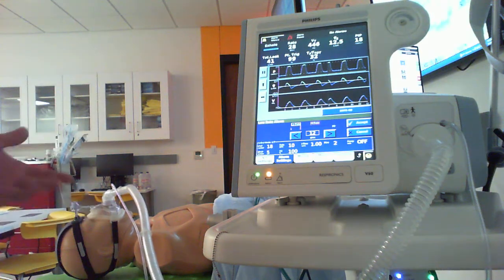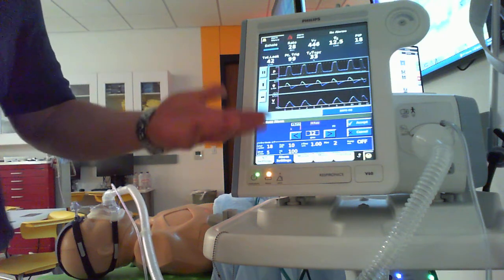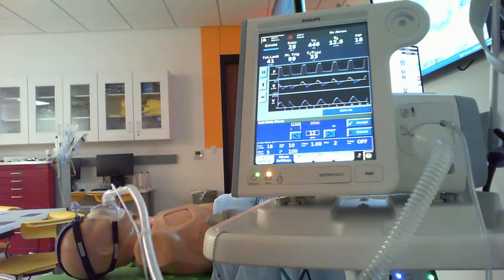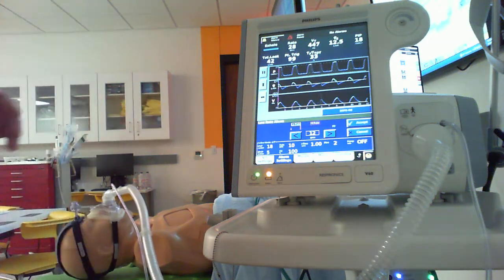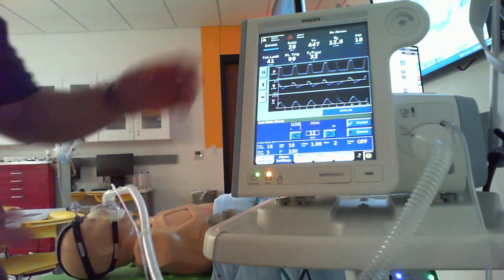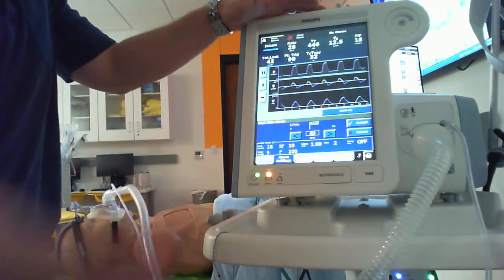Okay, if this patient's respiratory rate goes down to 12 or 14 or low end of normal, do they really need non-invasive ventilation? Or we look at that, or is something bad happening and somebody gave them pain meds too quickly? So I set it higher than the rate, but it doesn't have to be set crazy high. It's kind of a comfort level. 12 would be appropriate. High rate, okay?